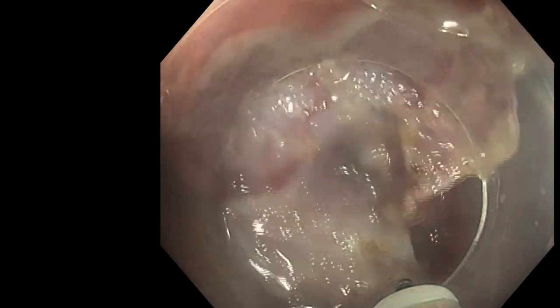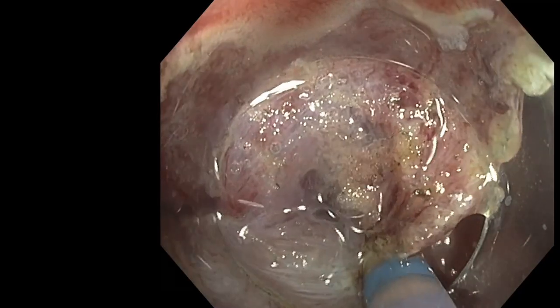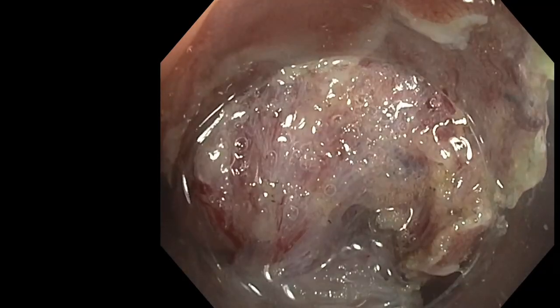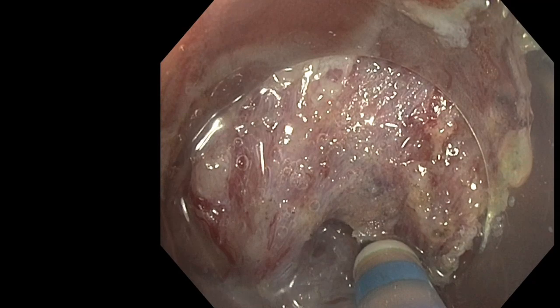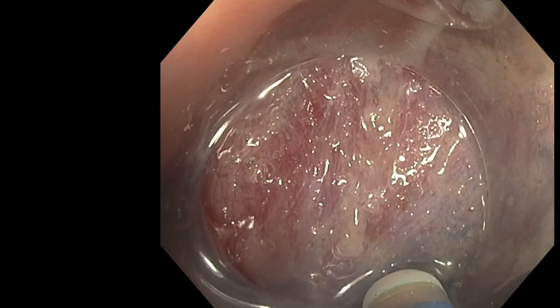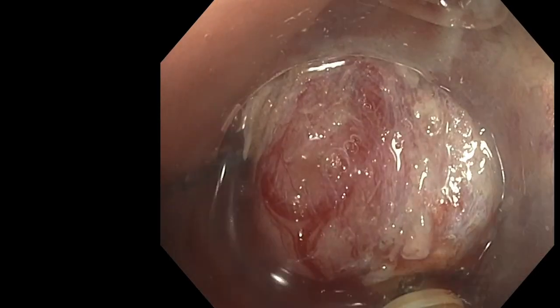It's difficult to go very fast in this case because you don't dissect tangentially in only one plane. You have a lot of 3D change. I mean, first we are going up and then we will go down into the diverticulum. We have the edge to cut where there is another diverticula which is fixing the submucosa. So yes, it takes time.